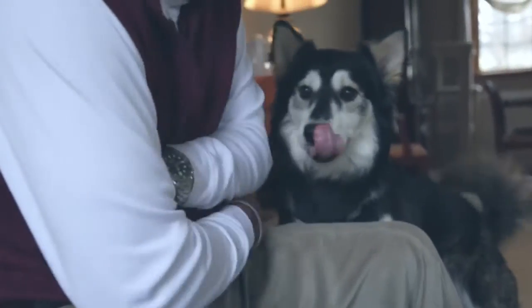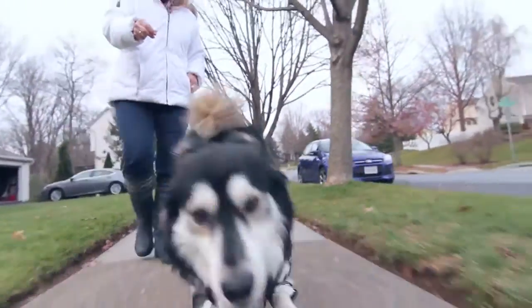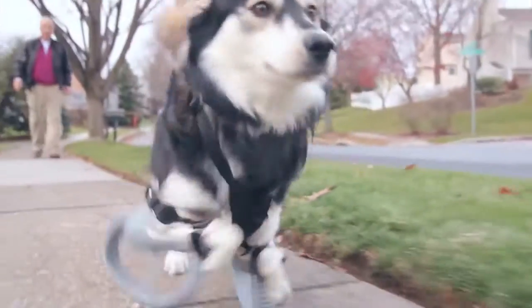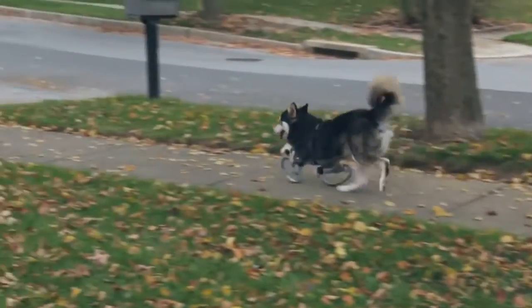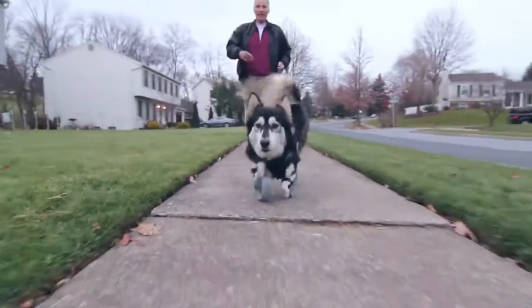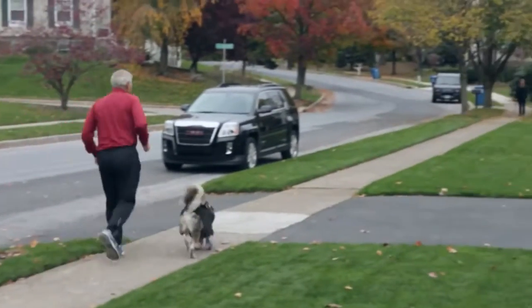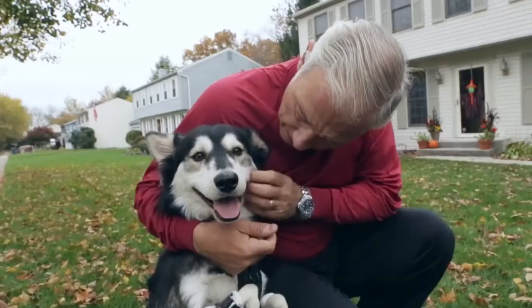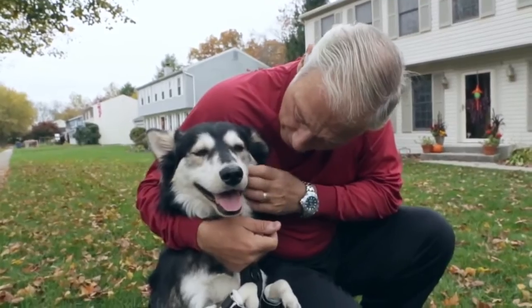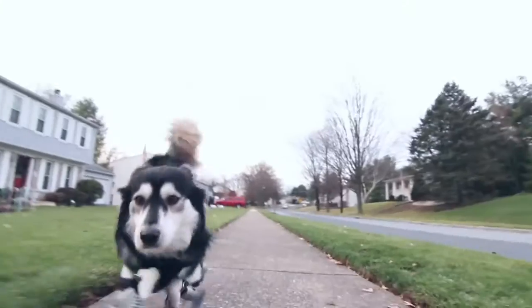I don't become impressed very quickly, but when I saw him sprinting like that it was amazing — I just couldn't believe it. The first time he was put on them and he took off running, he was just so happy. I was absolutely amazed at how well he did. He runs with Sherry and myself every day, at least two to three miles. He runs faster than both of us. He never really tires out. He's just so happy to do that.